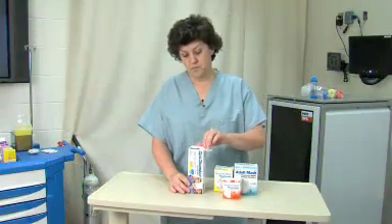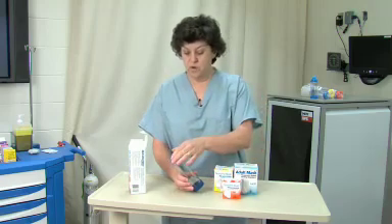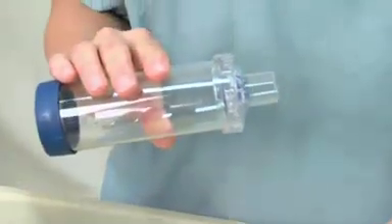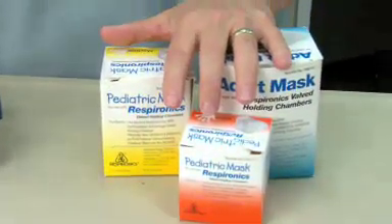The OptiChamber comes packaged with the mouthpiece. If you're using the OptiChamber in a patient population that is not capable of using the mouthpiece — they may be too young, they may be an older person, they may be in acute respiratory distress — we have a number of options to use in these patient populations.